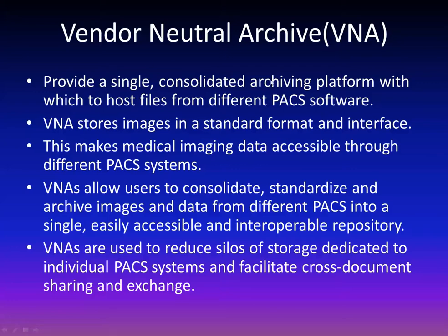And I did want to bring up something called a vendor neutral archive at this point. So a VNA is basically when you archive something. When you store something after your PACS, it's going to go into storage. And vendor neutral means that it is stored in such a way that it is neutral, so it can be transferred from one PACS system to the next.